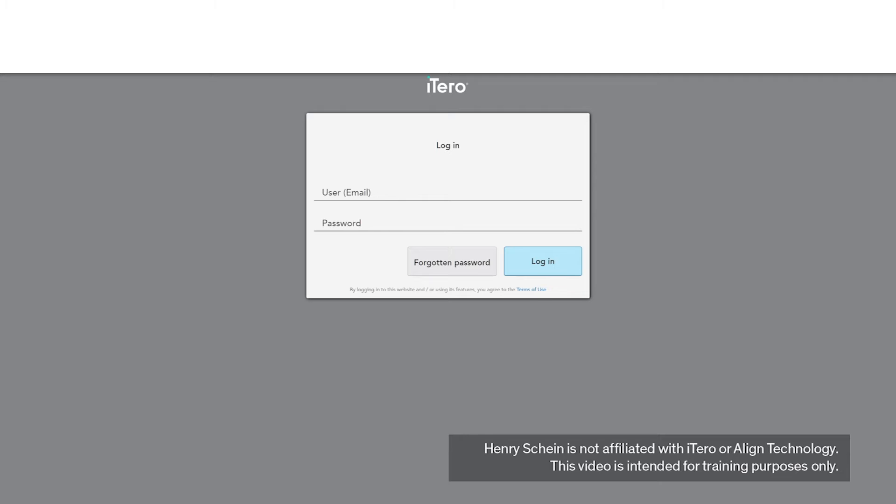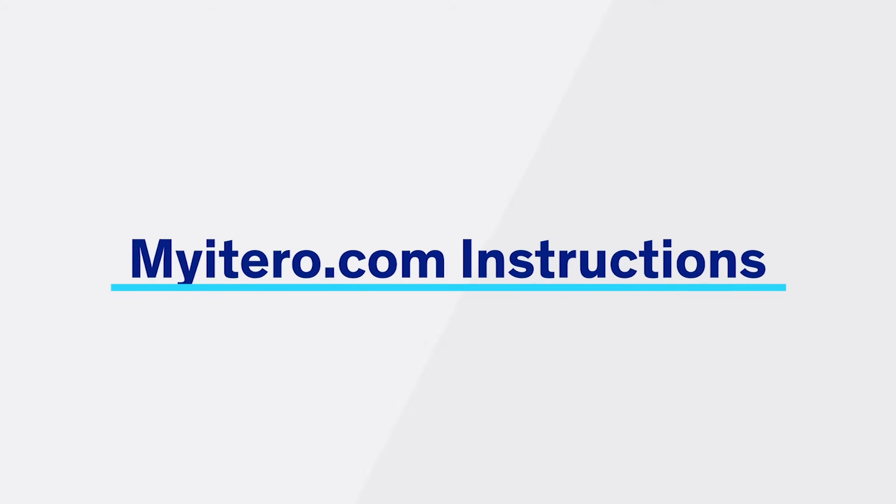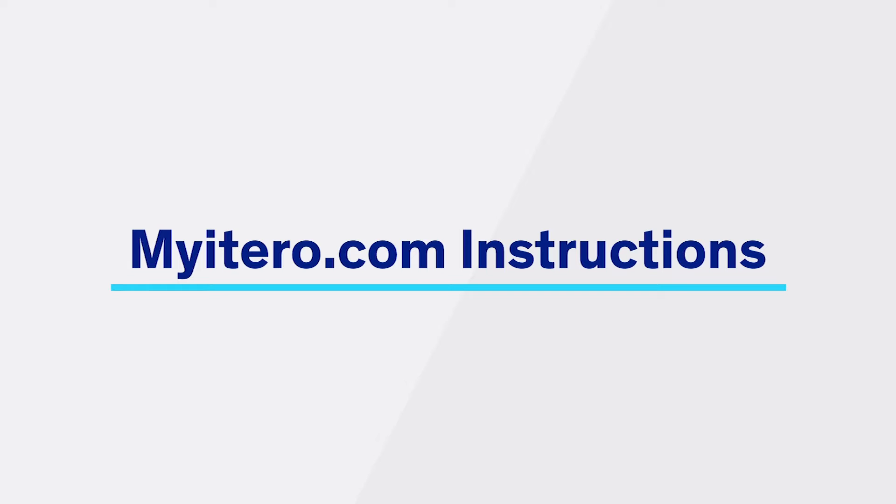All scans are stored online and can be accessed on myitero.com or mylinetech.com. To export STL scans from myitero.com, follow these steps.